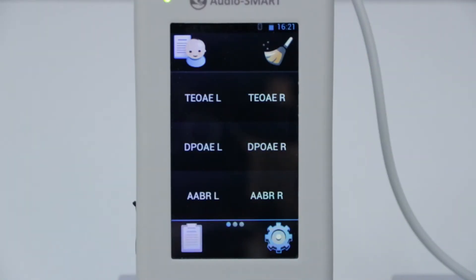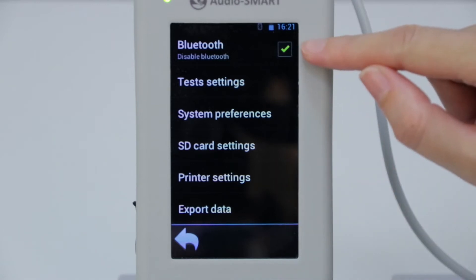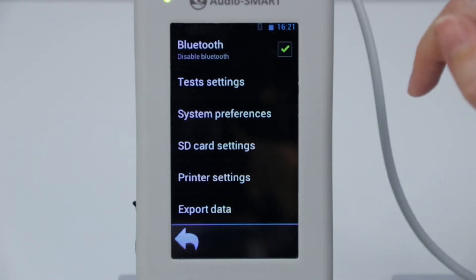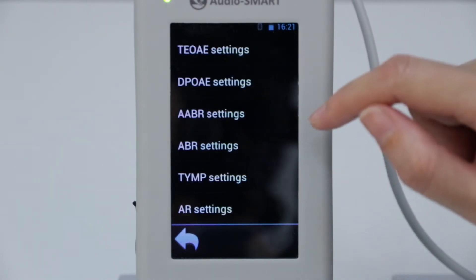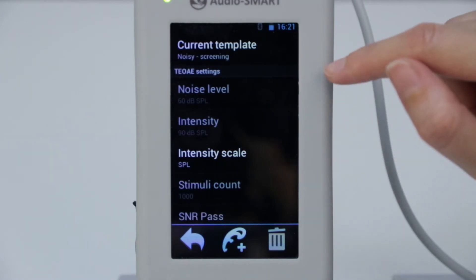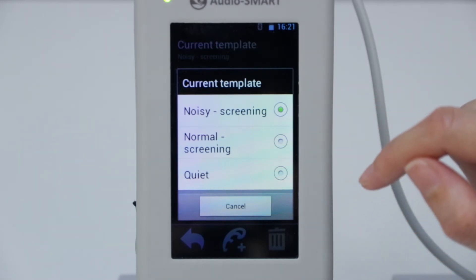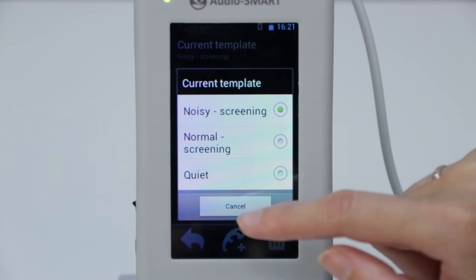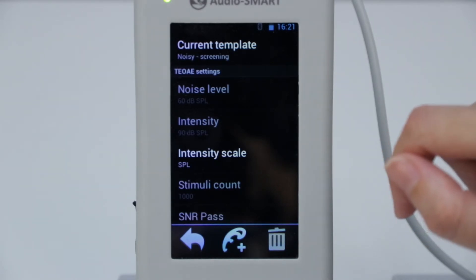Switch on the device. Now we are in the main program window. Go to the setup menu. Switch on the Bluetooth if you want to use a Bluetooth printer and export data to your AudioSmart Manager program. Now we can choose the test templates. Choose the necessary otoacoustic emission. We have some default templates we can choose according to our acoustic environment, for example, noisy or quiet. How to make your own template I will tell you at the end of this video.